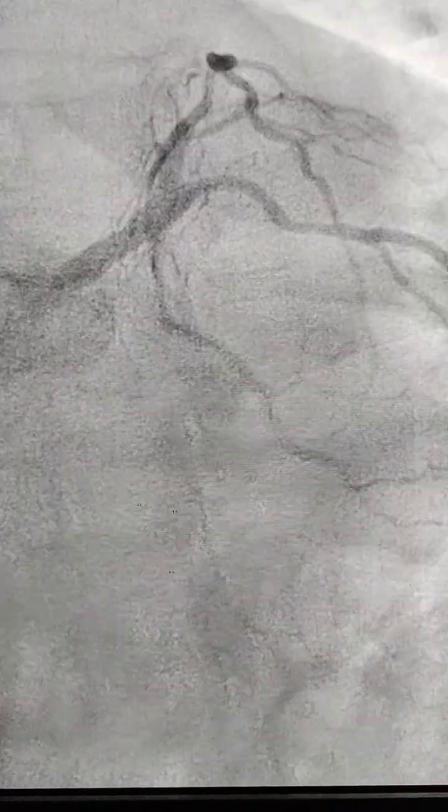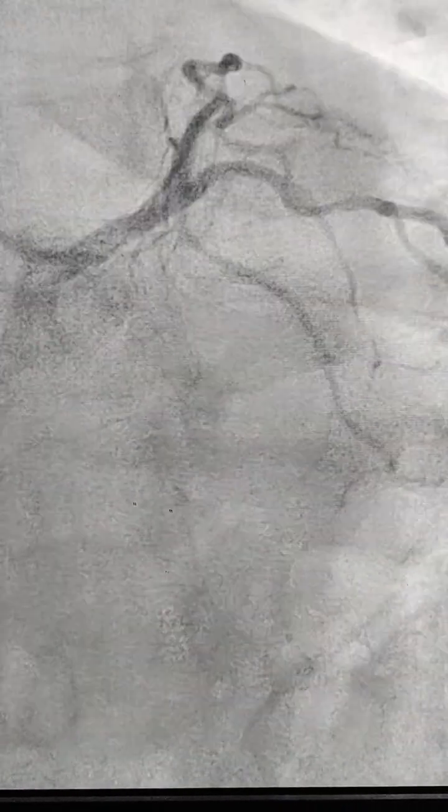This is a 50-year-old male who is a diabetic, a smoker, and hypertensive. He presented to the emergency department with typical chest pain, and on ECG was found to have ST elevation in the inferior leads. It's been 4 hours. He is suffering from the chest pain, so we explained everything and took him for the angio.